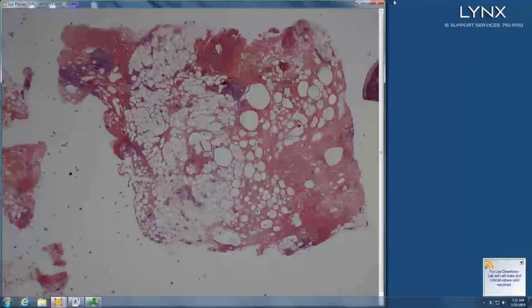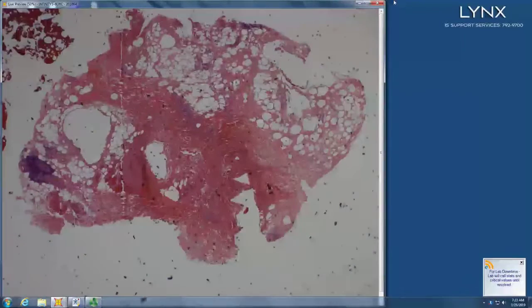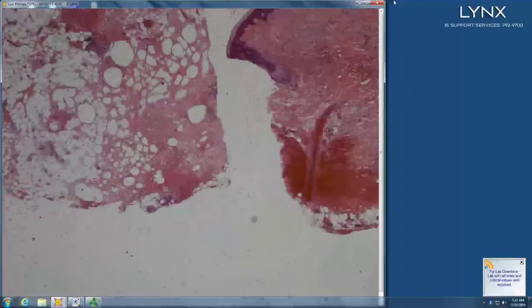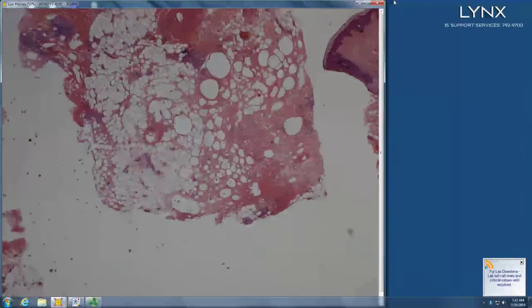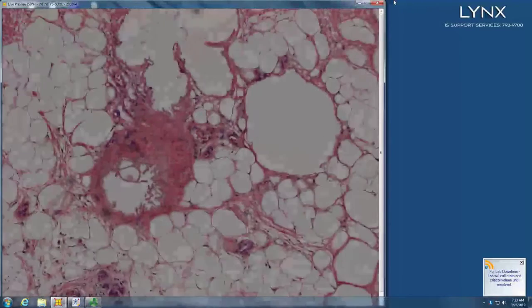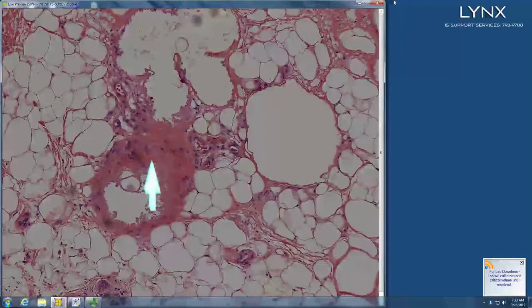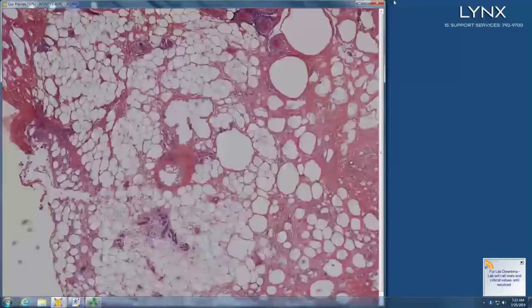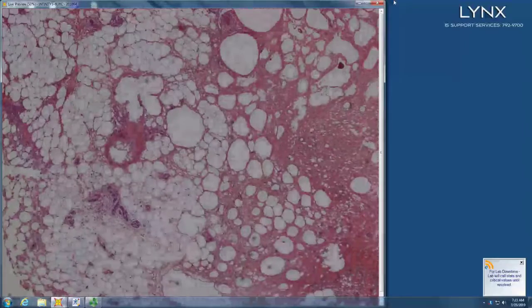So we've got a punch biopsy. That doesn't look super happy. Fat does not look happy. In fact, it looks necrotic. Lobular. So you have fat necrosis, necrosis of the lobule. What kind of change is this? Frost on a windowpane change? Like lipodermatosclerosis. Lipomembranous, like you'd get in lipodermatosclerosis.